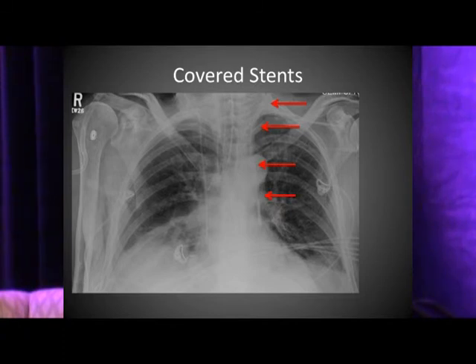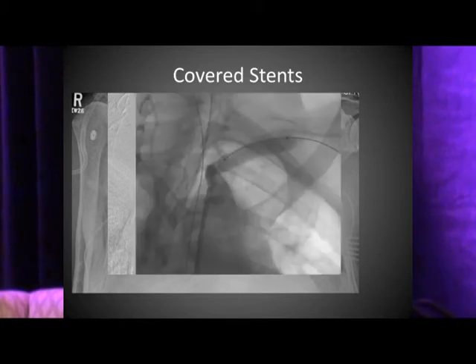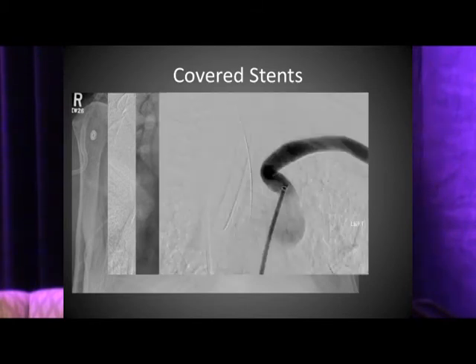This is our first subtraction, or a couple during the procedure. We have an ICAST or atrium stent that's up there. You can see right here, this is the vertebral artery coming up. This is where the temporary catheter is actually coming in and coursing down. We were going to try and preserve this. Unfortunately, we put in 1 stent. It jumped a little bit forward, so we put in another ICAST stent, and eventually, this was the first deployment. It moved a little bit farther than we wanted it to. But eventually, after 2 ICAST stents and a Viabahn stent, we were able to completely cover this once the temporary catheter was pulled out or explanted.